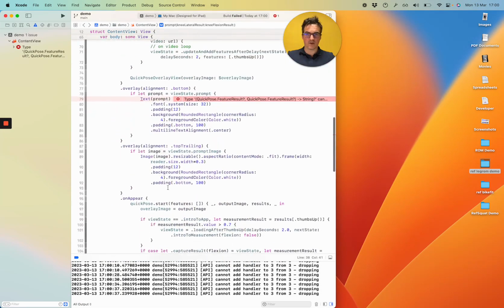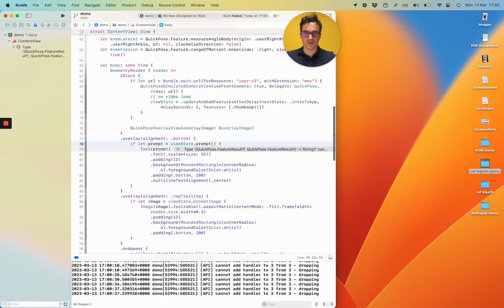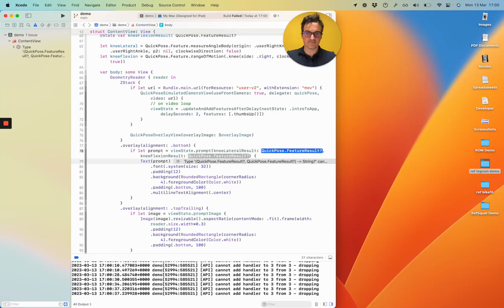Okay. Oh, we're getting an error. Oh yes, so we need to be passing the two prompts. So we've got knee lateral and knee flexion.